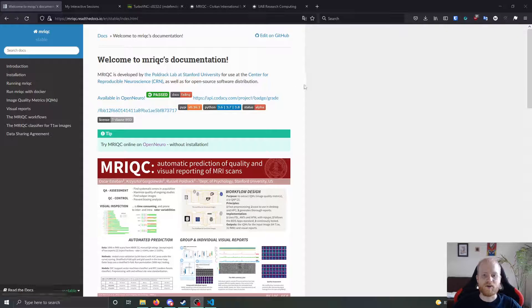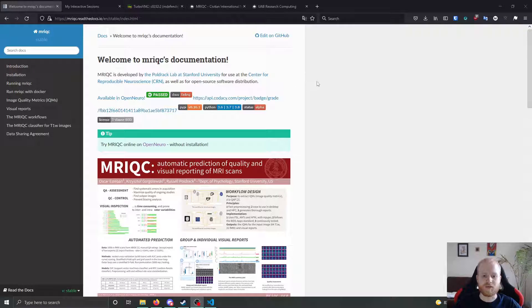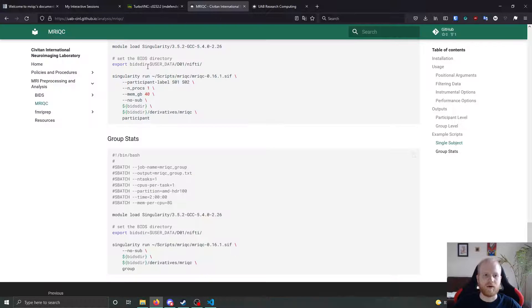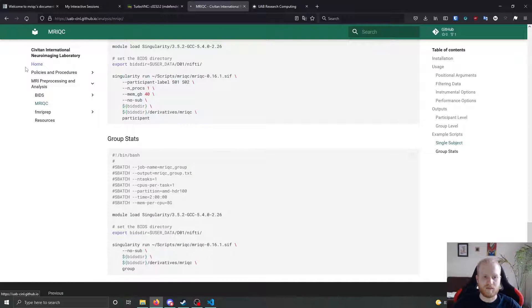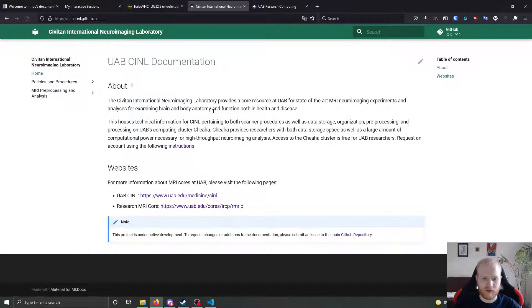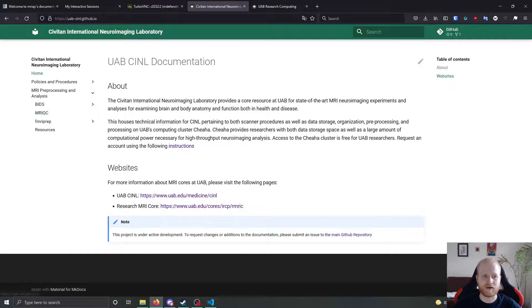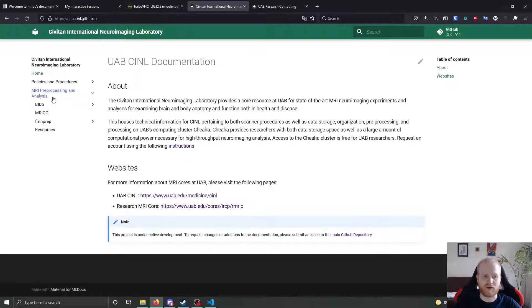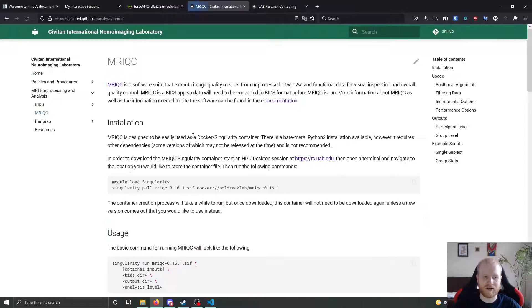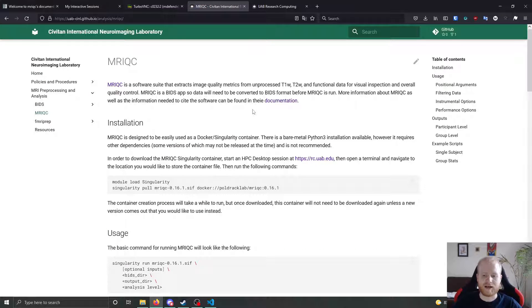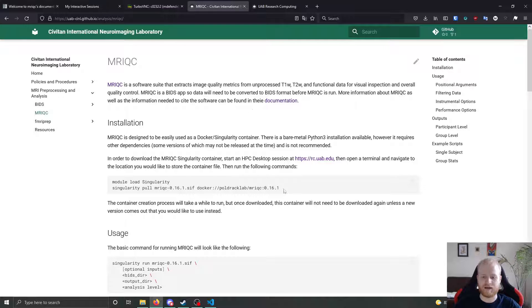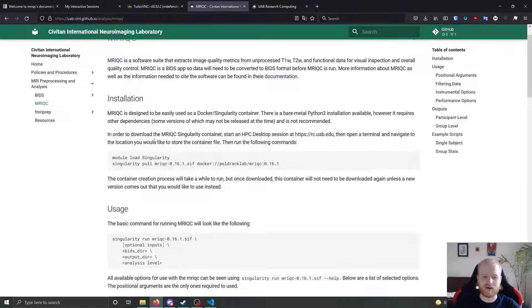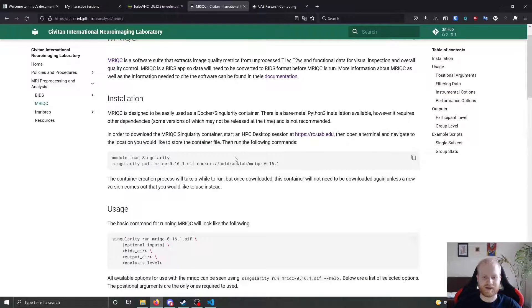So if you wanted to use MRI QC on Chihog, how would you go about it? Well, we have a page on how to use MRI QC at our documentation at uab-cinl.github.io. If you go down to the MRI preprocessing and analysis section, you can click on MRI QC.